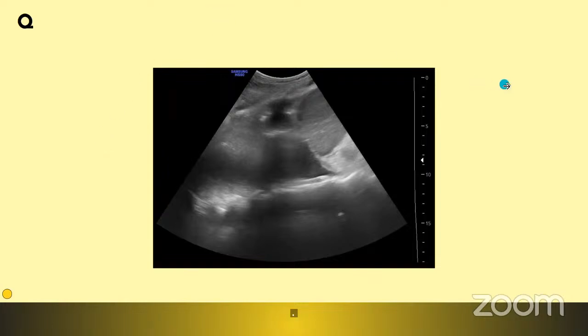Okay, another piece of information I would like to give you. Initially in chest X-ray classes and CT classes, we were telling you that we need to identify the site, etc. Here there's nothing like that in ultrasound, because this whole thing is a real-time as well as a faster procedure.